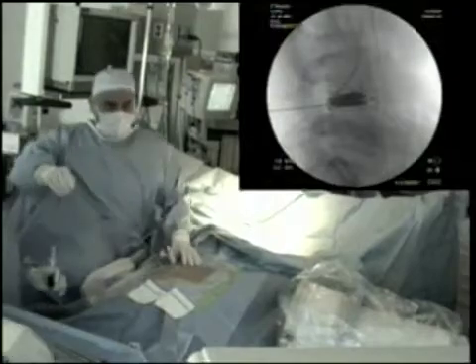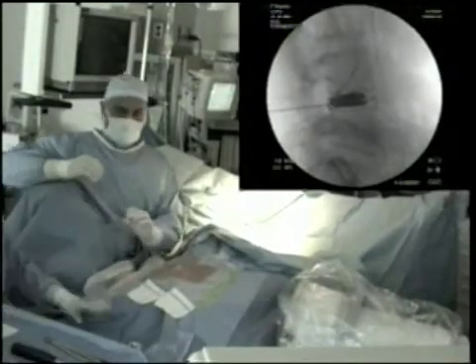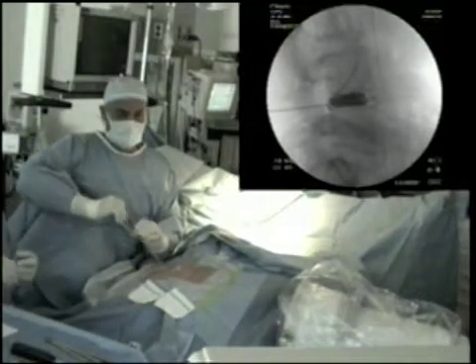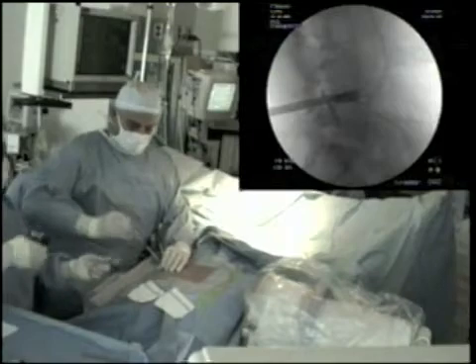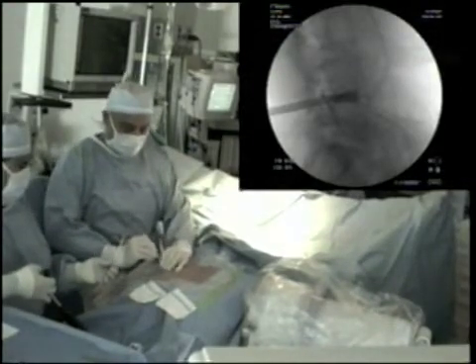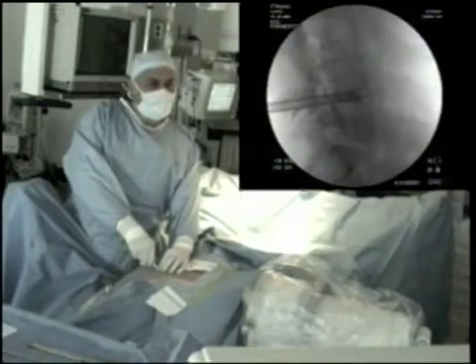The first stage in the operation is the insertion of a 10-inch 18-gauge needle through the posterolateral margin of the affected disc. The insertion of a blunt dilator followed by the insertion of a 9mm sheath allows access into the centre of the disc.